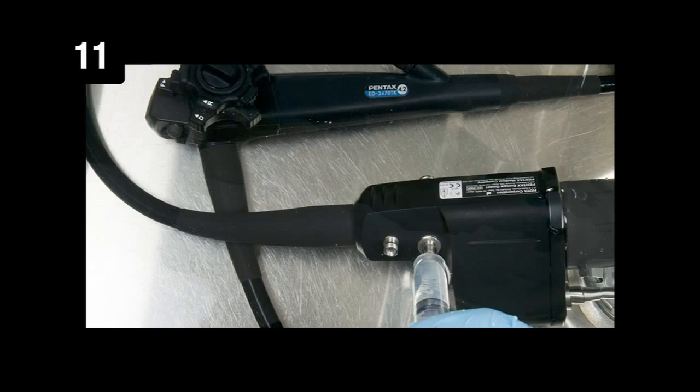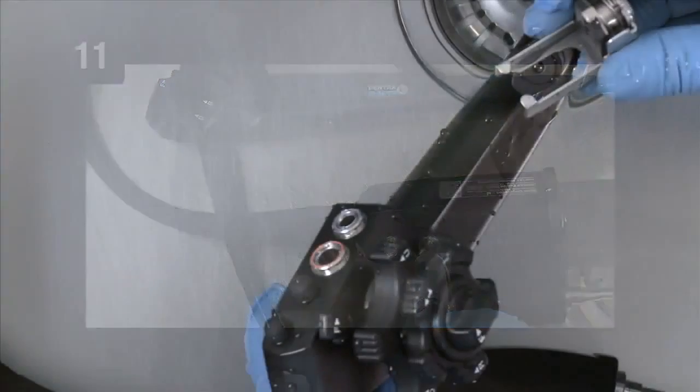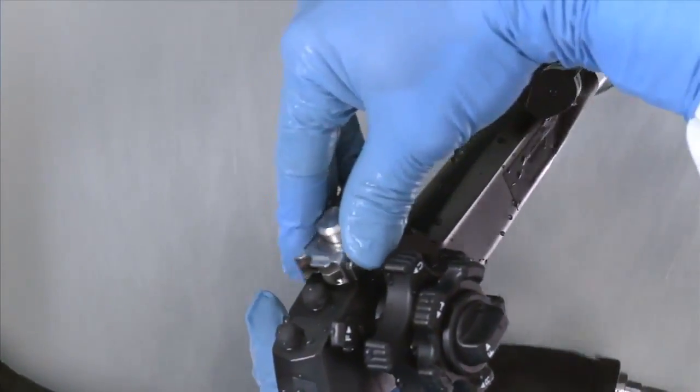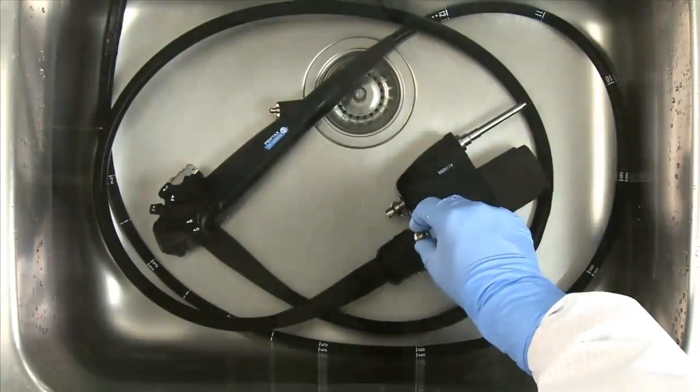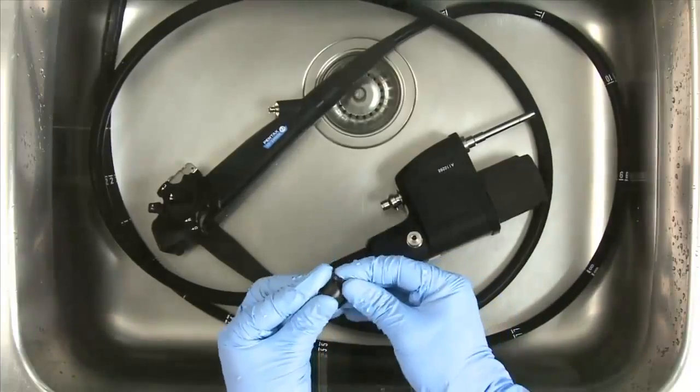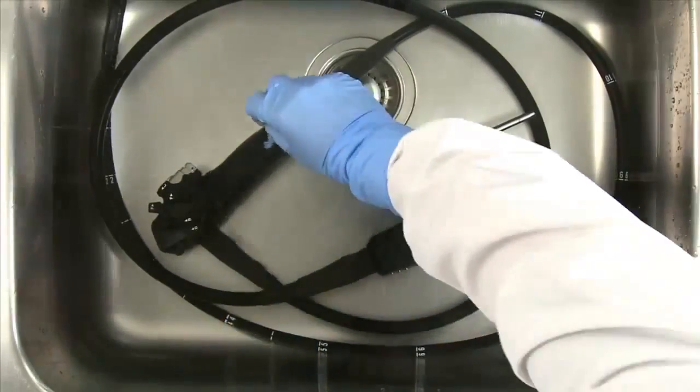Step 11. Flush the channels with diluted enzymatic solution. Attach the air-water suction cleaning adapter to the control body of the endoscope and the air-water channel cleaning adapter to the PVE connector. Reattach all removable components, such as the biopsy inlet cover.